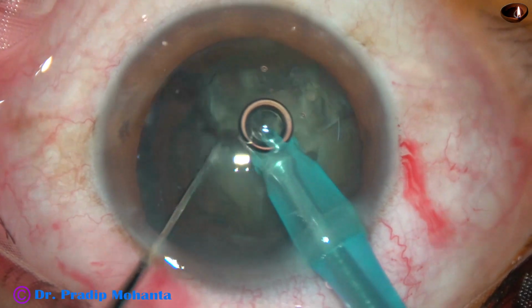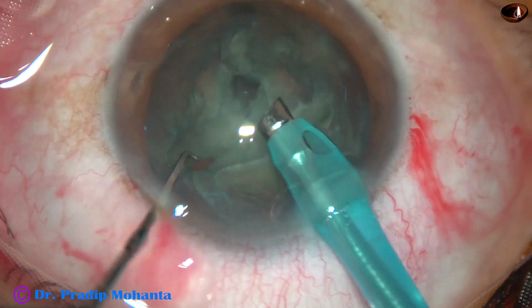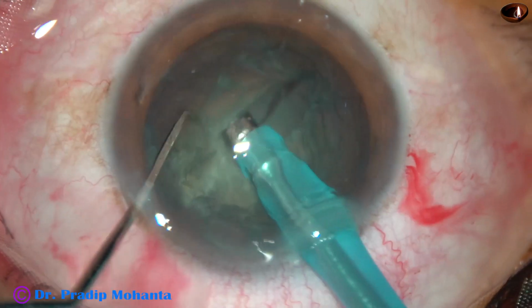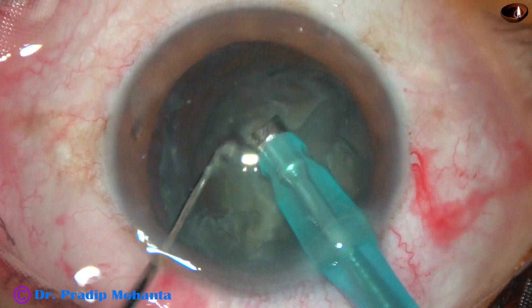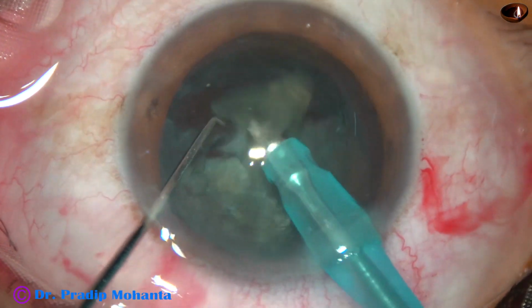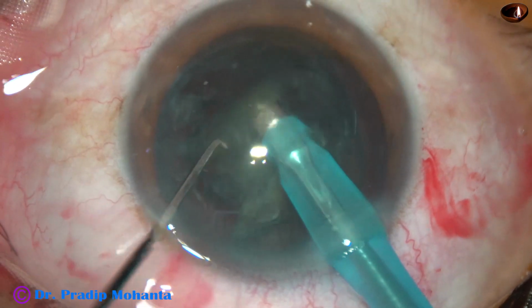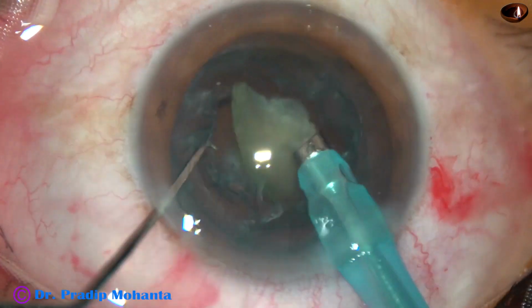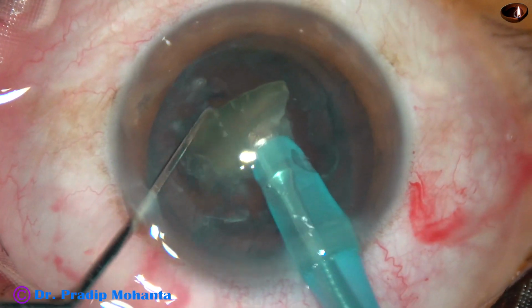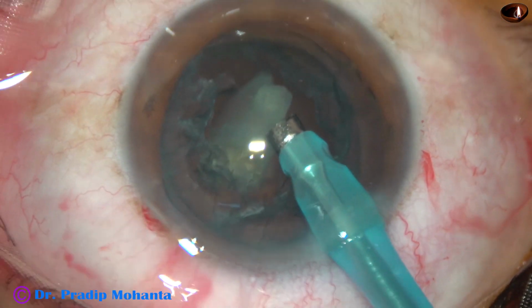I do everything: horizontal chop, vertical chop, even chopping the very hard cataracts with this simple chopper. It's a totally blunt chopper. It's not round, it's flat on either side. At the end it is just a blunt end.